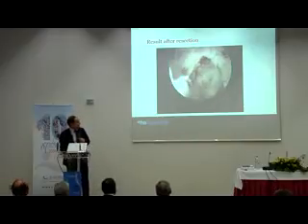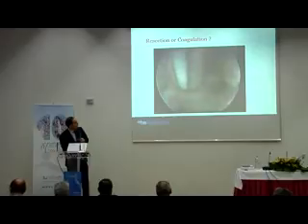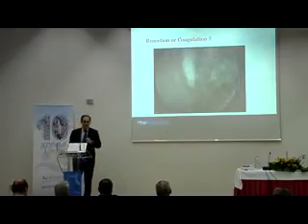Now, in the same woman, we find another cyst. She has a lot of cysts, so we have removed one for pathology, and here we use a special bipolar probe, and we will coagulate the whole surface. And now we look at the results.